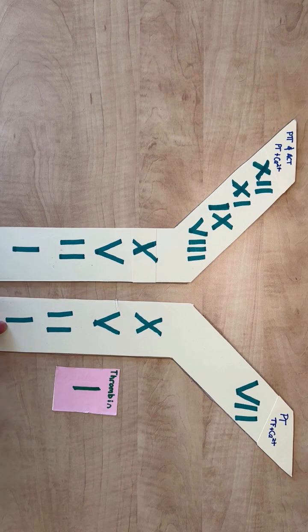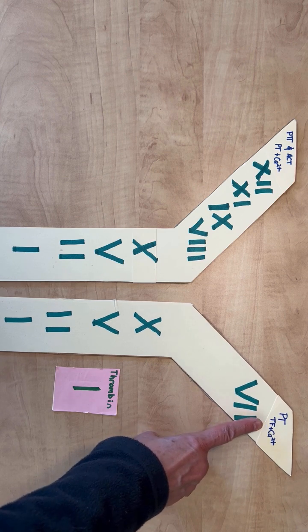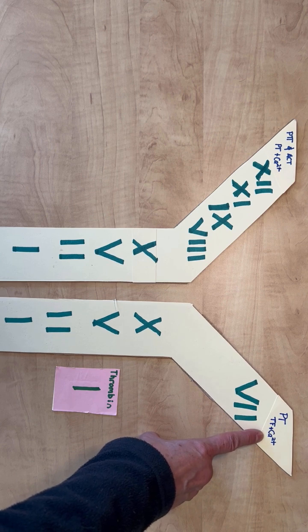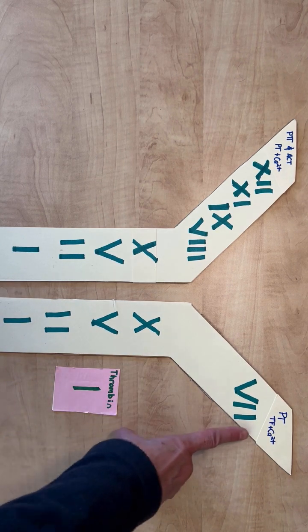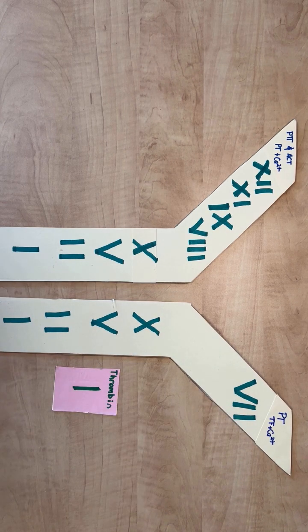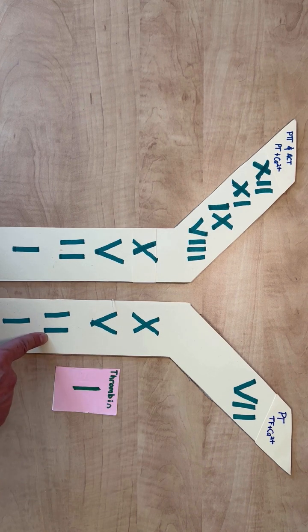Taking the extrinsic factor pathway first, we add tissue thromboplastin. This is a reagent you buy from a chemical company, and it contains phospholipids and tissue factor. We also add an excess of calcium to the test tube because it is required for the forward reaction. So we add tissue thromboplastin, calcium, and blood to the tube, and we wait to see how long it takes for a clot to form. That is the prothrombin time test, or PT, and it is how we assess the extrinsic factor pathway.